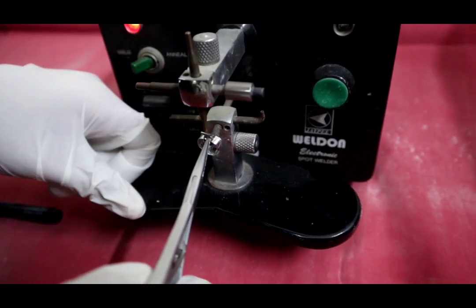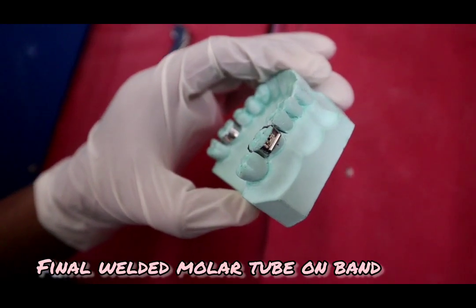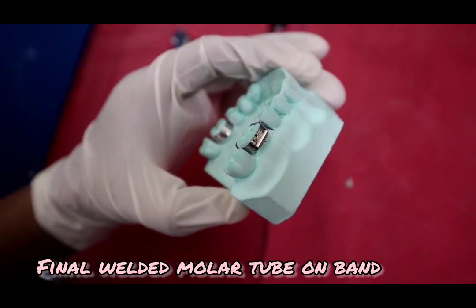Then for making the final weld, again place the band and tube between the electrodes and make two welds on each side. This is how the final welding of a molar tube on a band looks like.